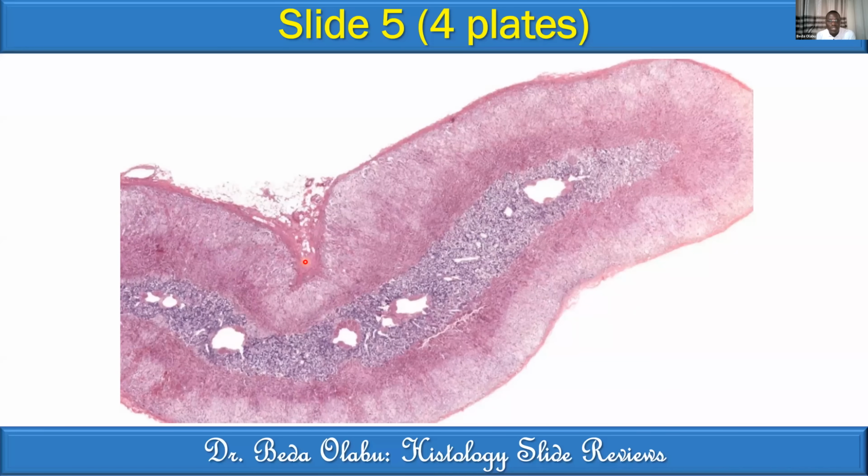At the second magnification, we confirm that we see the connective tissue capsule. It looks like a thick connective tissue, actually. It's a dense connective tissue, most likely dense irregular connective tissue. The outer zone is very compact. We confirm the inner zone is less compact. Different staining as well. And in the inner zone, we see large vascular channels as well. So that's what we are picking at that magnification.